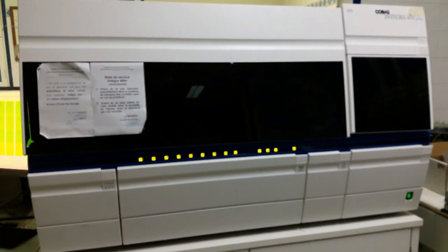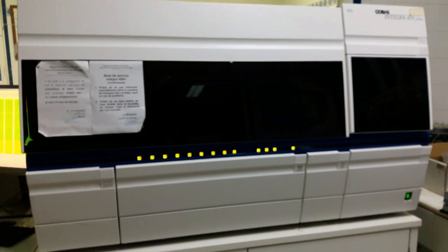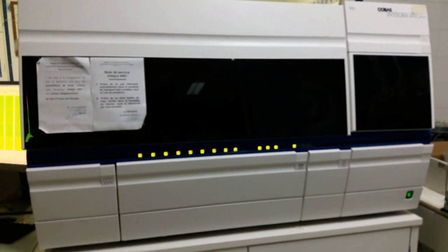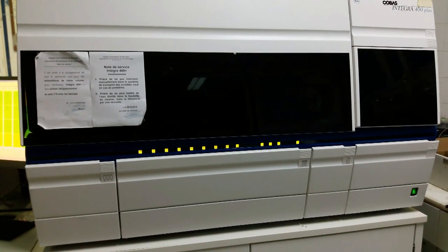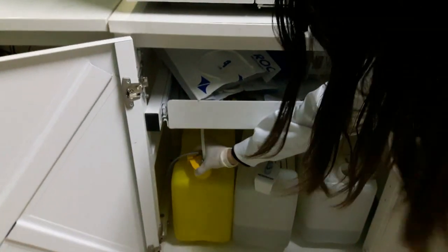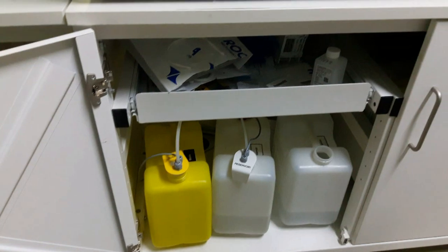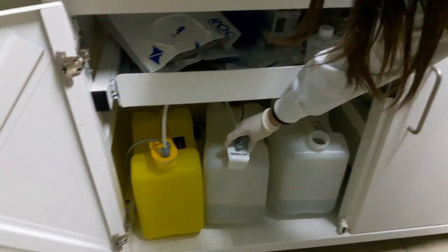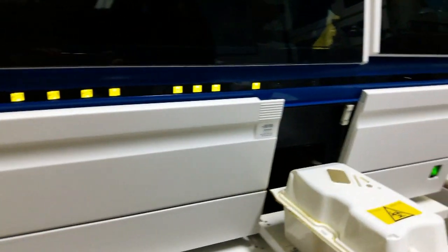Avant de commencer les analyses biochimiques, il faut tout d'abord faire la maintenance de l'appareil. Dans notre cas, c'est Cobas Integra 400+. Chaque matin, il faut vidanger le déchet liquide qui se trouve dans le réservoir jaune, ce qu'on appelle Waste. Il faut remplir le réservoir blanc avec de l'eau distillée. Il faut vidanger le box, la poubelle, le déchet solide.